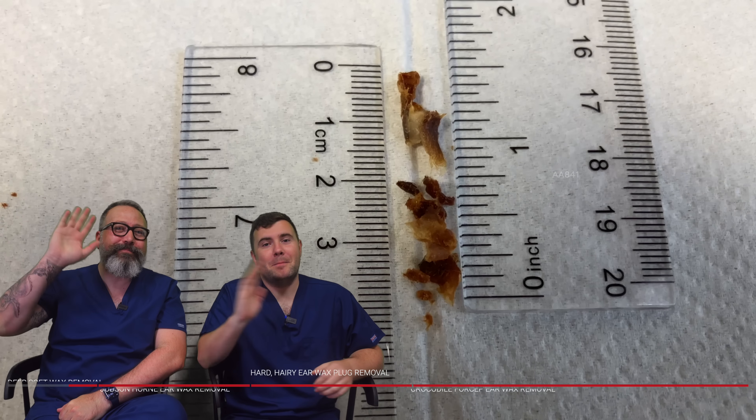I thought it might have been a little bit too soft with the forceps — it did look like that. A little bit of skin, maybe? A little bit of keratin at the top. That's really what you're hoping for when using these manual tools — as we're pulling these bits forward, we're hoping that it pulls everything further forward into the ear canal entrance. I think that's what's happened here. It's pulled right near the entrance of the ear — great with these narrow ear canals when this happens. So much easier to remove. What a good job. That was absolutely perfect — spot on.